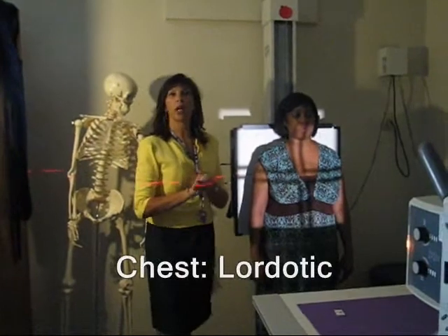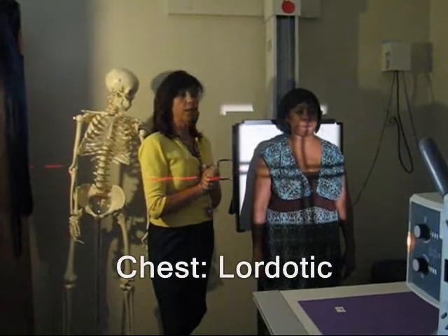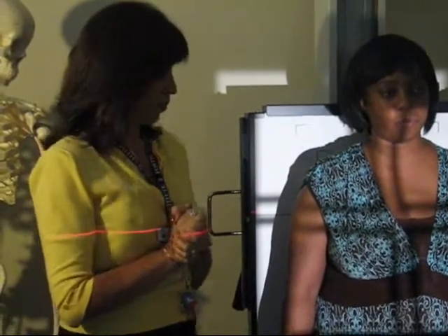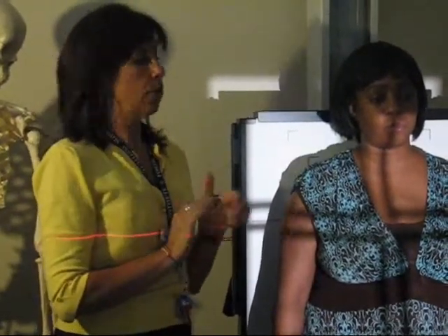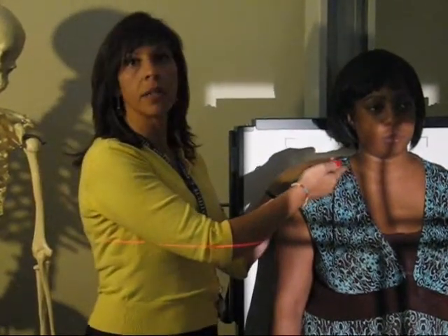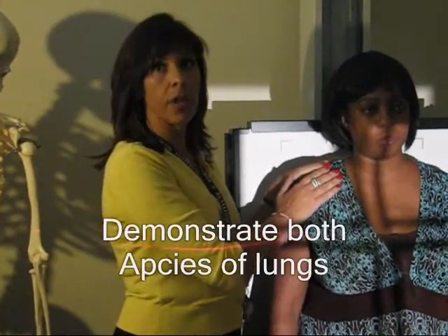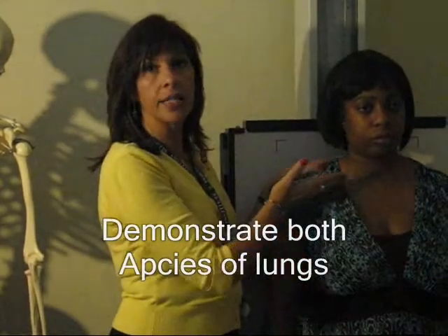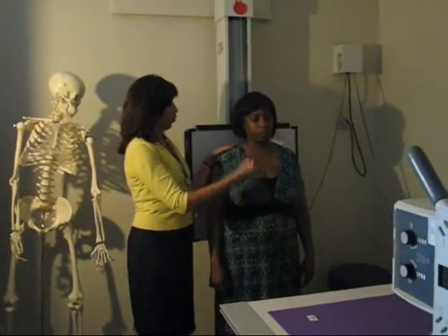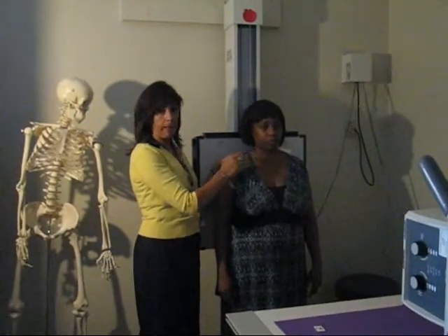A special view or projection of the chest is called the lordotic projection. The goal of this is to actually see the apices of the lungs without any superimposition from the clavicles. So we're going to want to shoot at an angle, basically.